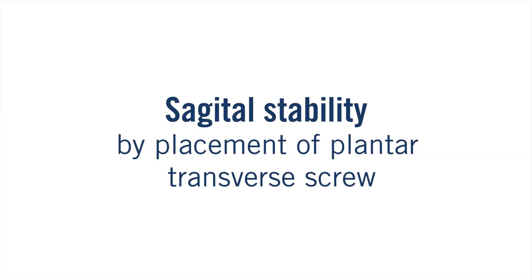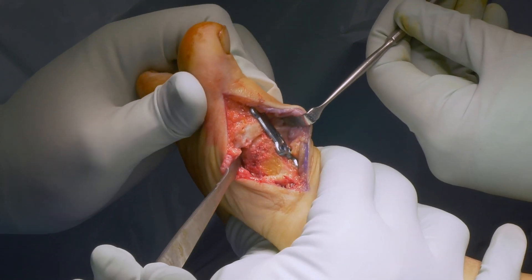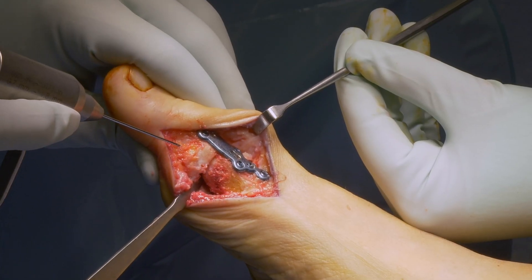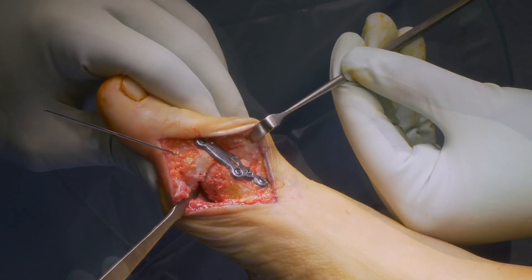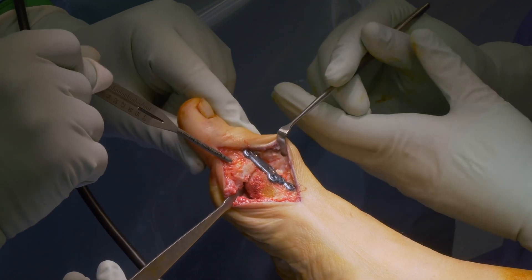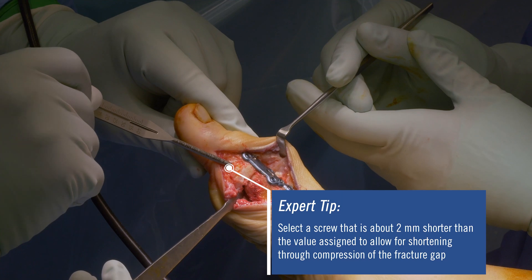Sagittal stability by placement of a plantar transverse screw: For ideal sagittal stability and plantar compression, insert a home run screw — an oblique phalangeal metatarsal screw. Insert a 1.1 mm, 100 mm long K-wire from distal to proximal. Measure the length and insert a CCS 3.0 screw.